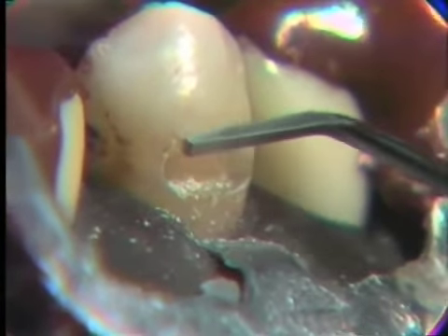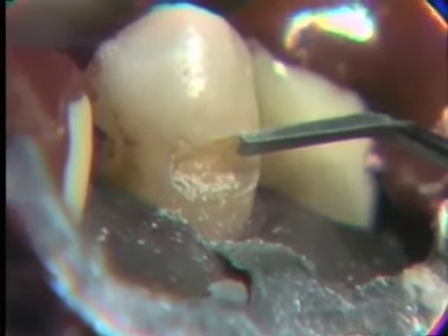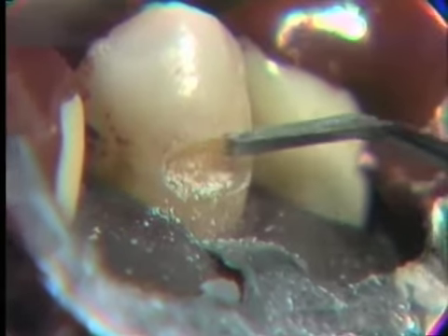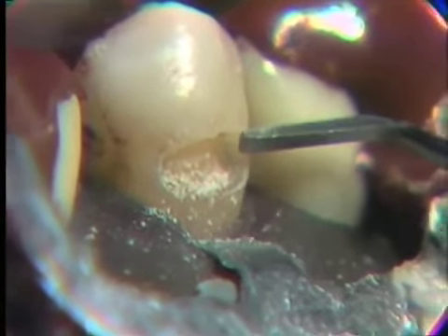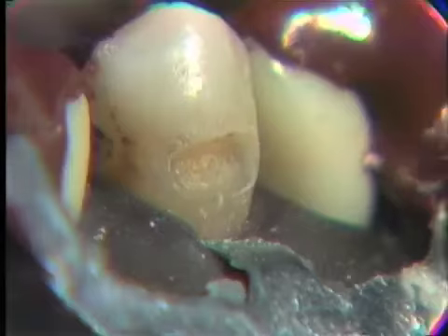The final margins of your amalgam restoration cannot ever be any better than the cavity margin that you prepare. If you prepare a smooth margin, you normally will have a very, very smooth wall, or smooth margin on your amalgam restoration. I think this is highly important to you for the success of these amalgams.